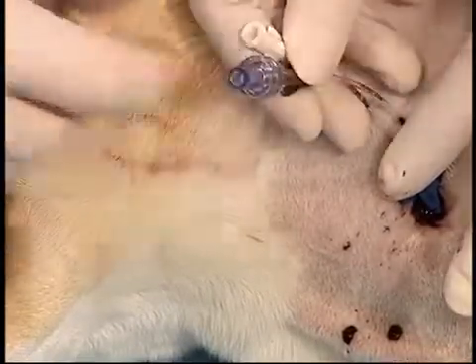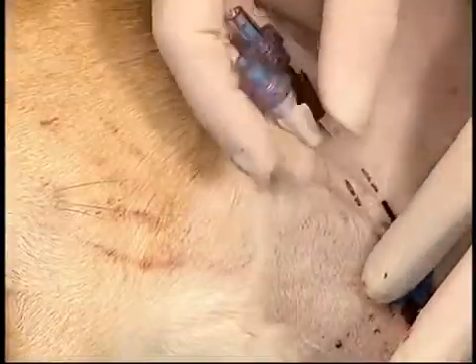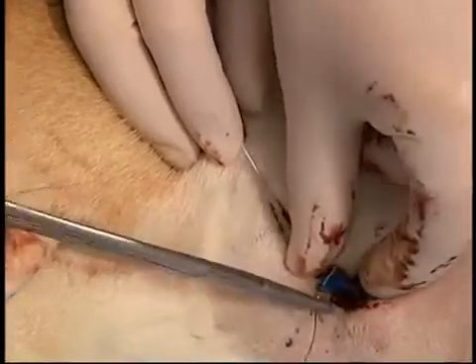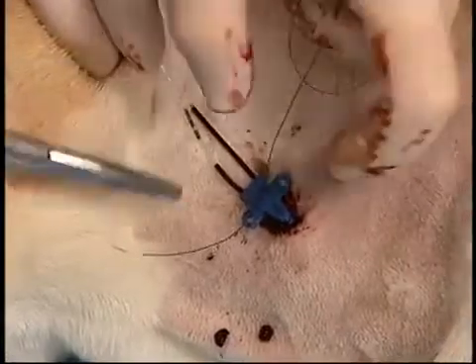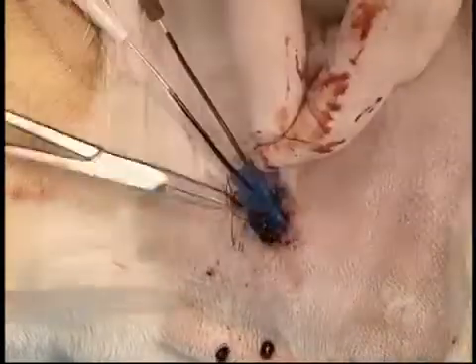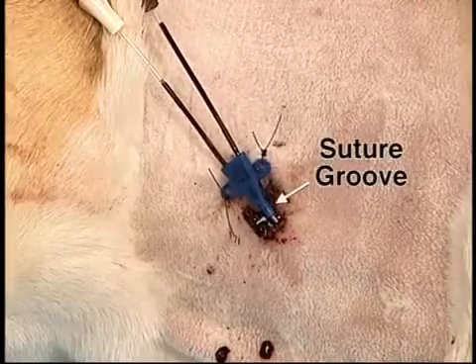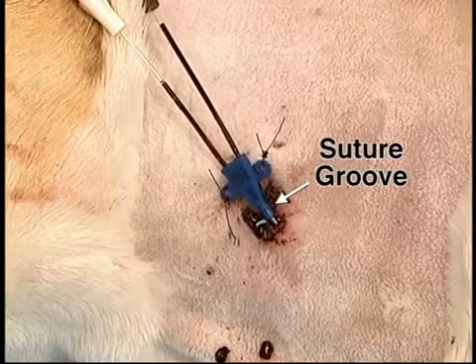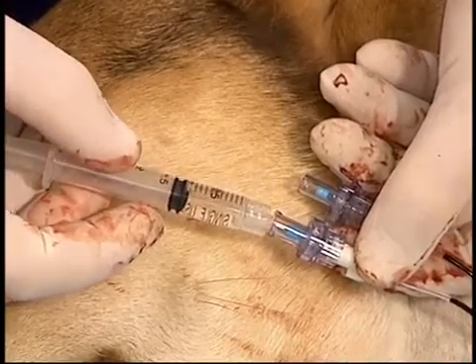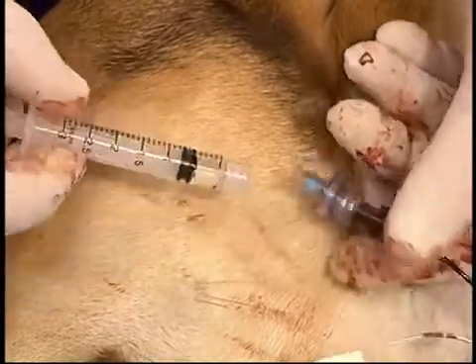A needleless injection cap is then inserted over the top of each hub to prevent blood leakage from the catheter, and then the catheter is sutured in place. The other suture can be placed around the distal suture groove and through the skin. Each lumen should then be flushed. The advantage of these needleless injection caps is that fluid cannot come in or out of the catheter until the central valve is depressed. Blood should be aspirated to ensure appropriate location of the catheter, and then the catheter should be bandaged.